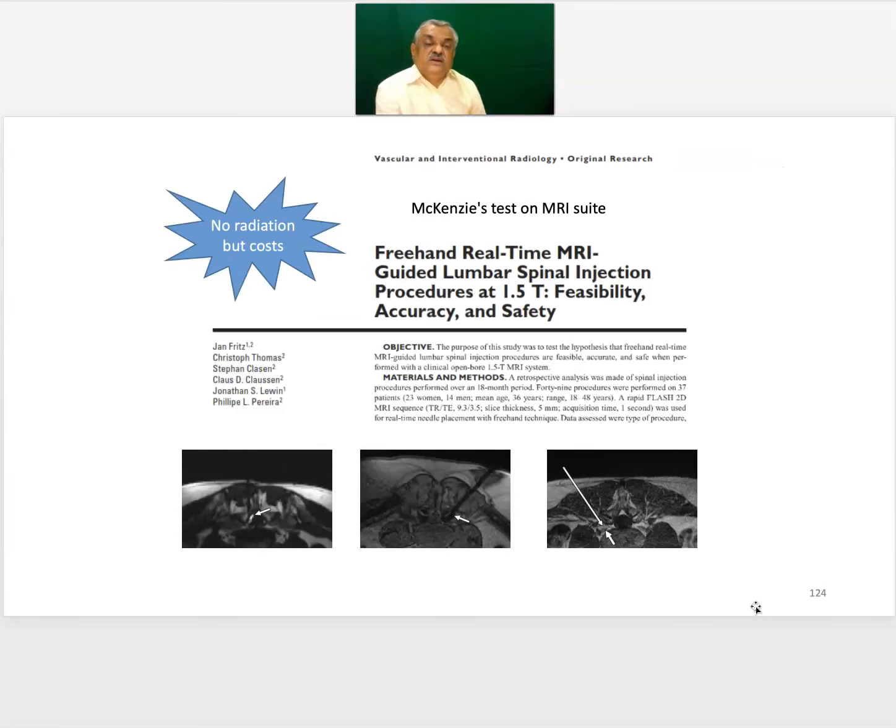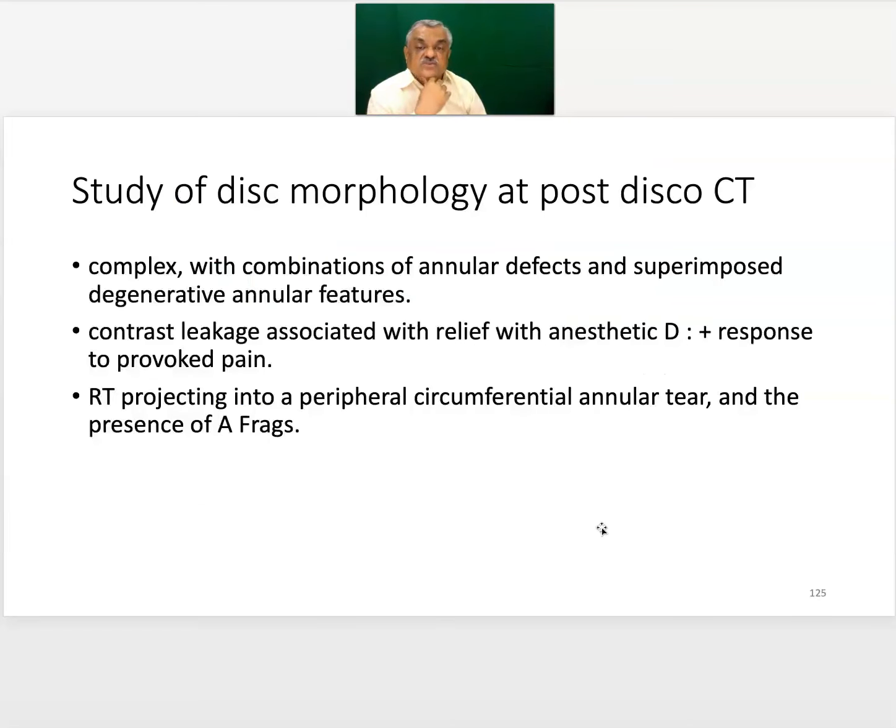Now here we are looking at freehand real-time MRI guided injections where they have shown they are doing an epidural injection posterior midline, they are doing a transforaminal injection, and a periradicular injection. Now there is no radiation, but the costs are very heavy. So routinely we do not do a MRI guided injection, even though it is possible. Now there is another important aspect of imaging, which is the CT.